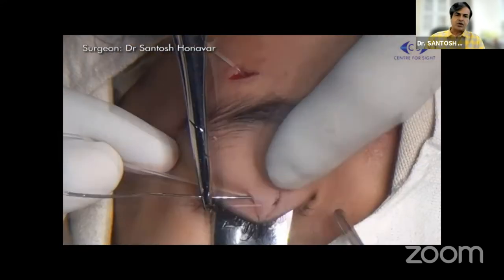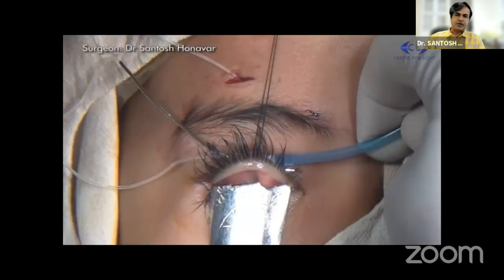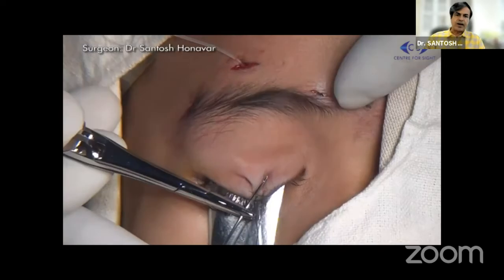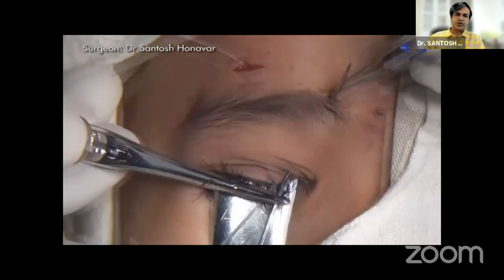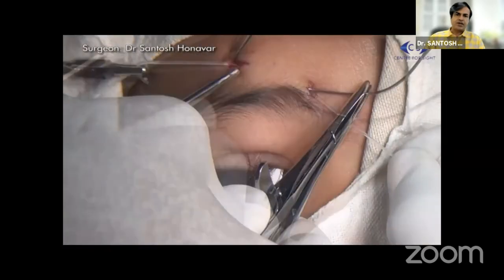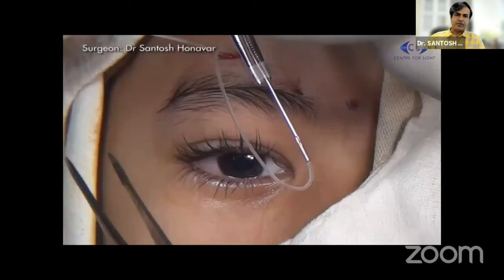Horizontal passage over the tarsus in the epitarsal plane — not through the tarsus. Make sure that you haven't perforated the tarsus full thickness. It can happen with a sharp needle and a thin tarsus. Then go back to the medial supra-brow incision, come through in the horizontal plane, and finally complete the pentagon by passing the sling back over to the central forehead incision with a three to four millimeter gap between the first and the second arm.